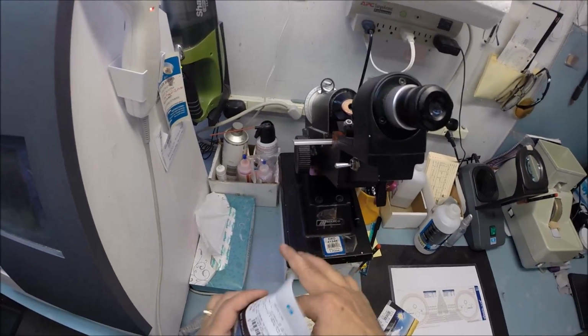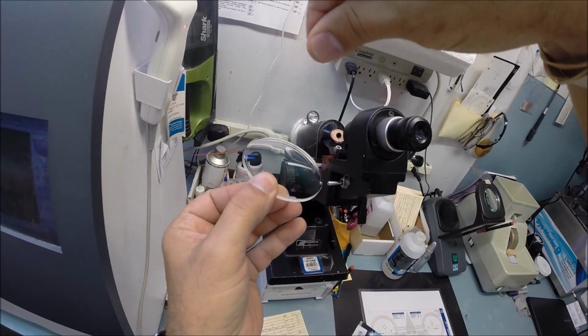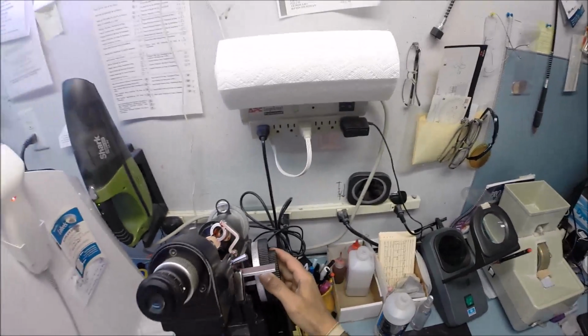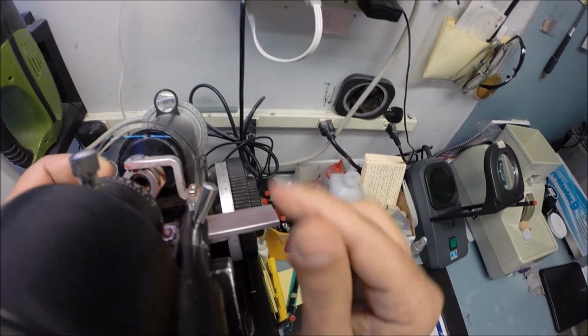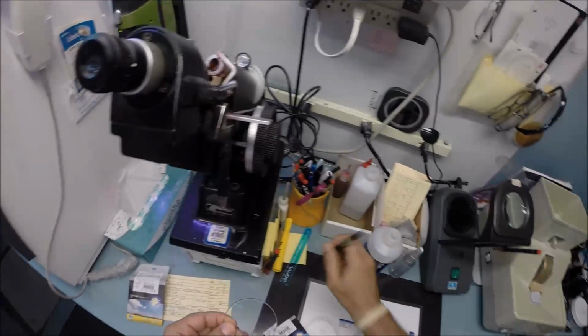So let's take the lens out of the protective wrapper. Comes with a little laminate on the front of the lens, like when you pick up a little mouse by the tail. Help me, help me. Okay, so we'll get rid of that. Let's make sure the lensometer is zeroed out. We're gonna put it on -1 1/4. All right, find the center of your lens. And let's put 1 dot in the center this time.